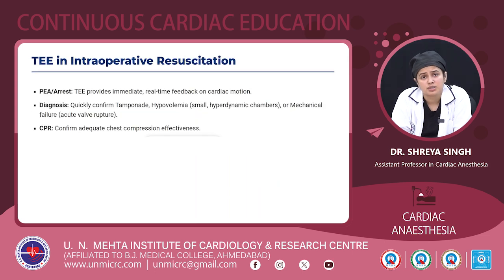TEE can also be used in intraoperative resuscitation, where it provides immediate real-time feedback on cardiac motion. We can quickly confirm tamponade, hypovolemia, or mechanical failure. It can also tell us about the adequacy of chest compression effectiveness.